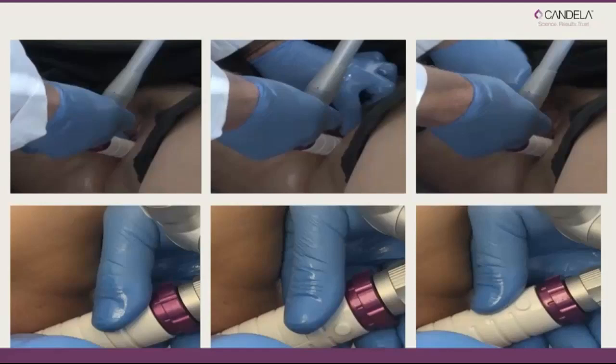So we have the modalities that I've used on this type of patient. I have used the fusion mode for this type of patient. And I have also gone to the mid mode, and I have used the light mode, as I showed you, when a patient wants a micro laser peel.